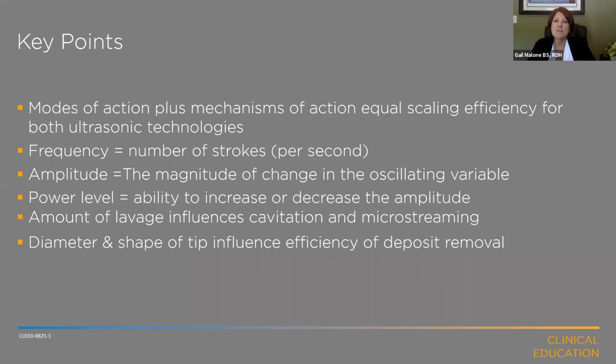So that really brings us to the end of our technology section. I hope you walked away with maybe a few things that were new to you. But just from a summary standpoint, we've covered the modes and mechanisms of action for both ultrasonic technologies, piezoelectric and magnetostrictive, focusing on frequency, amplitude, and power level.